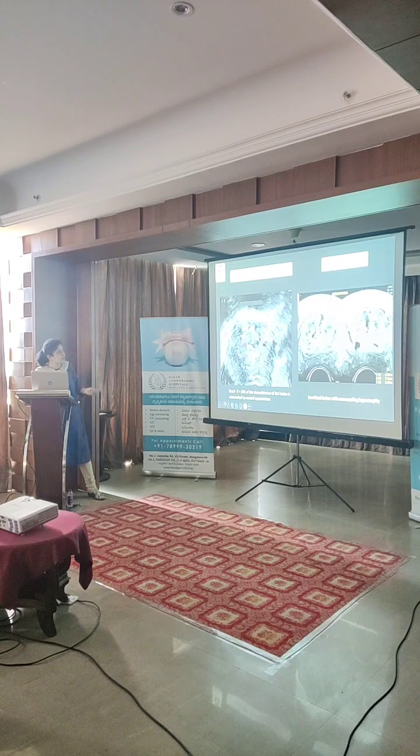And you can see you cannot even measure this. It becomes so difficult because you cannot see the margins of this lesion. I'm going to go back to my other modality now.